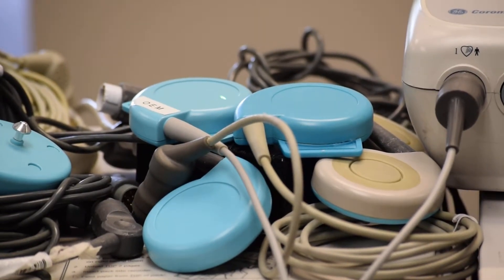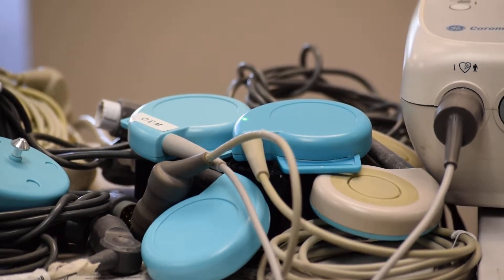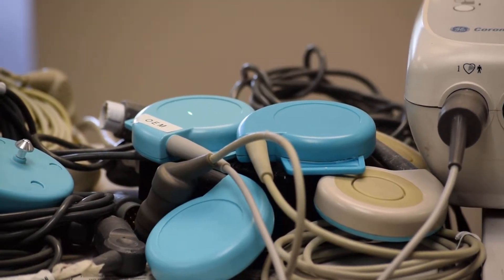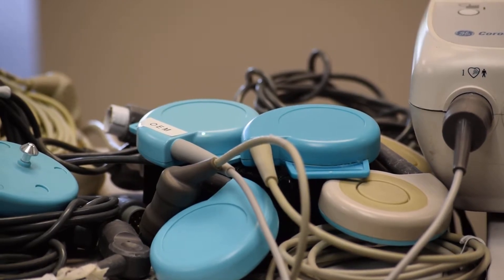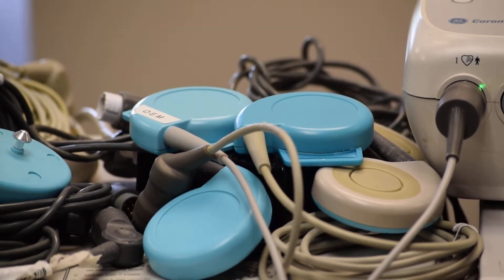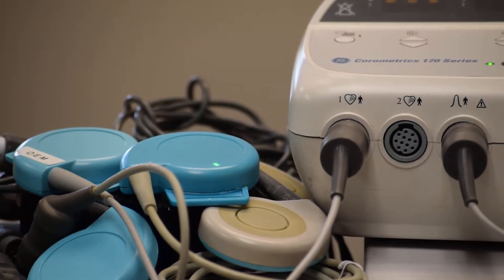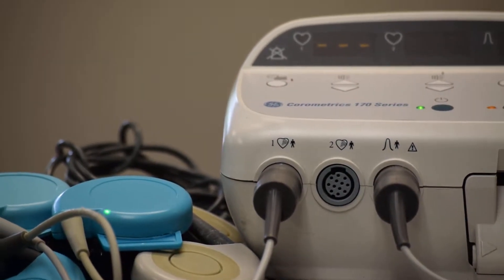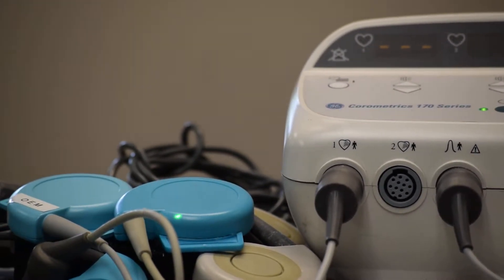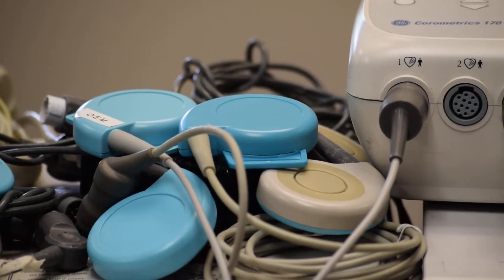What do you see here? There are two ultrasound transducers from GE Corometrics. On the left side, marked as OEM, is an original from GE Corometrics factory — 100% all parts are from the GE factory, never repaired, brand new transducer connected to port one of the 170 series fetal monitor. The second one is a non-OEM transducer — 100% all parts are non-GE, including plastic casings, connector cables, and relief crystals.